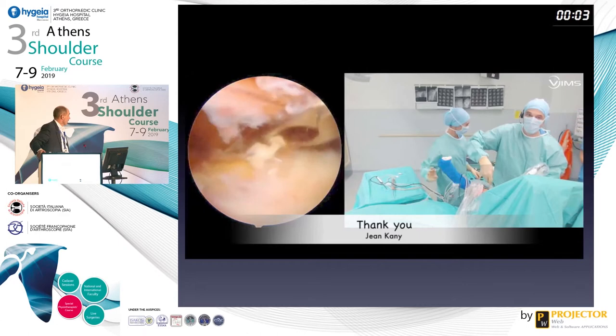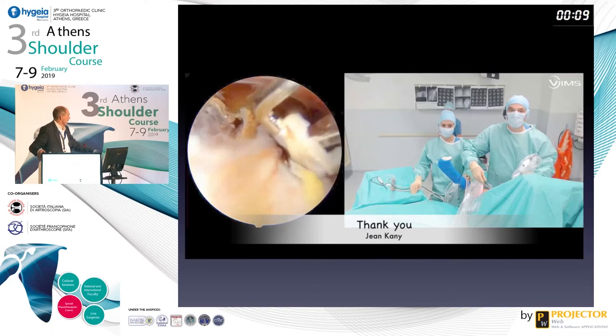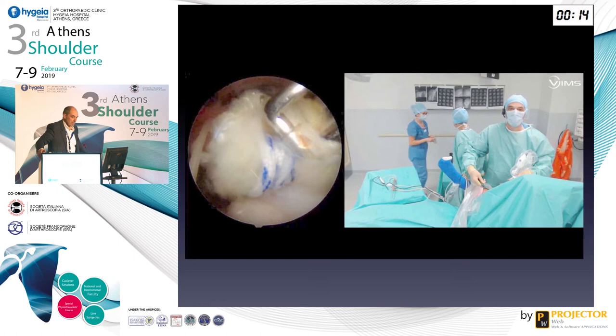So if you go back into the axillary field, you can see the teres major. And in fact, we've just turned and switched the lat dorsi from about 4 or 5 centimeters from its natural insertion to the footprint of the subscap. Okay, thank you very much.